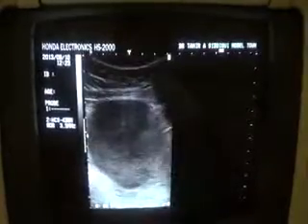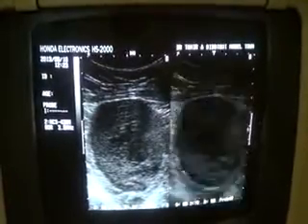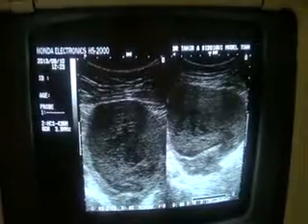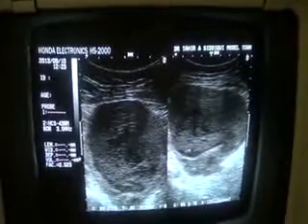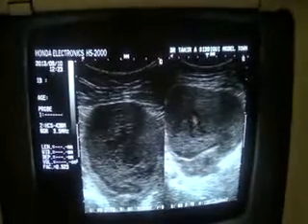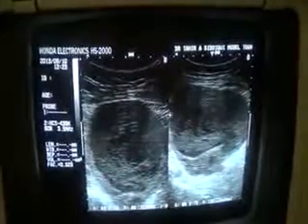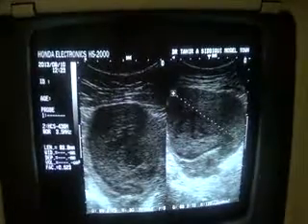And if we wish to get the approximate volume of this cystic area, it is almost an anechoic cystic area. These are the echogenic areas. These are all mild, low-level echogenic areas. Few cystic areas are seen. In this, you can see a central irregularly outlined cystic area. We did not see any calcification or solid element in the cyst.